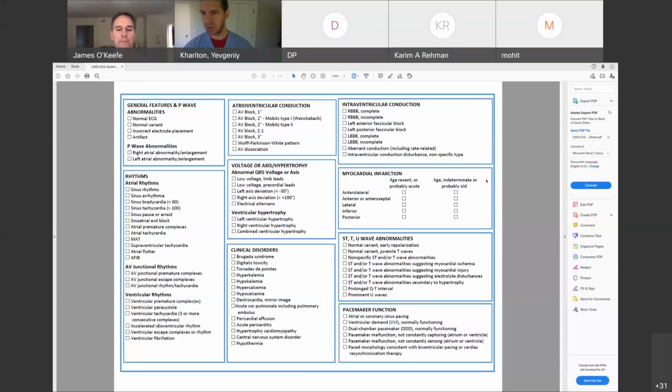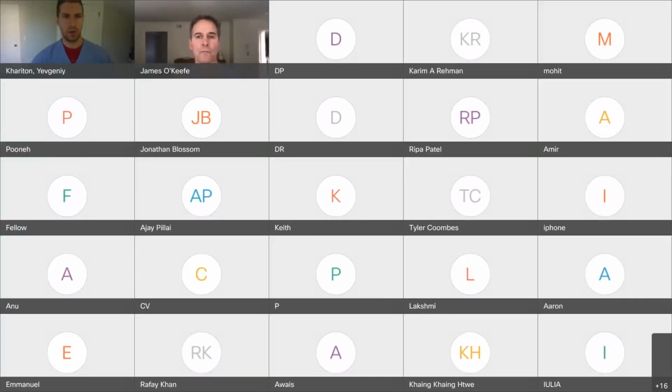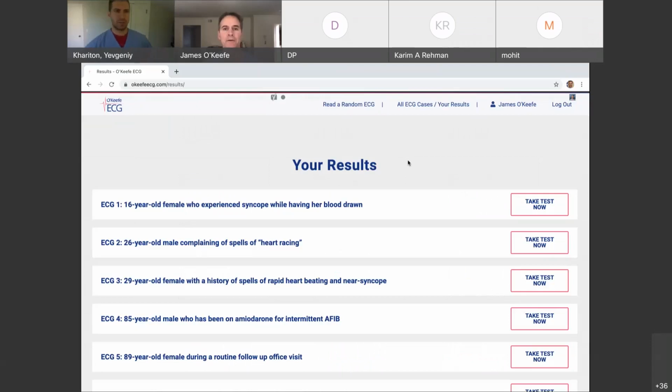All right. Dr. O'Keefe, if you want to go ahead and share your screen. Okay. Perfect. How's that look? Looks great. All right. Well, we'll just start into this.